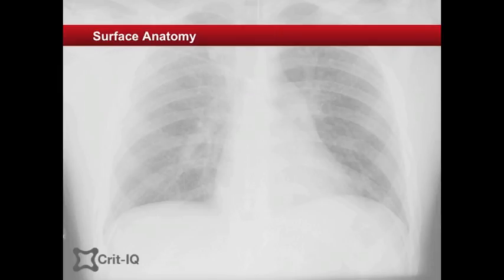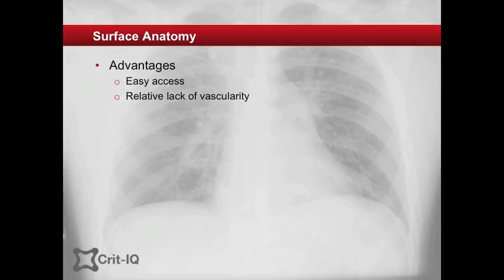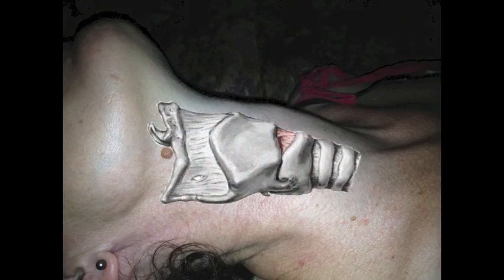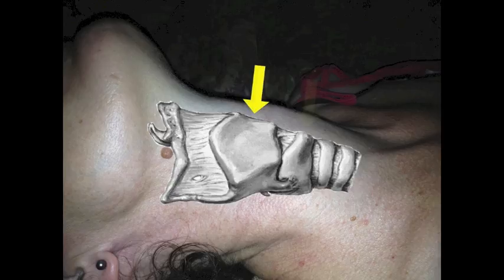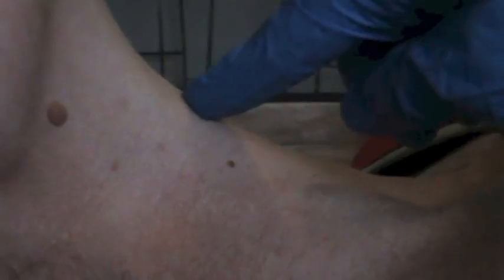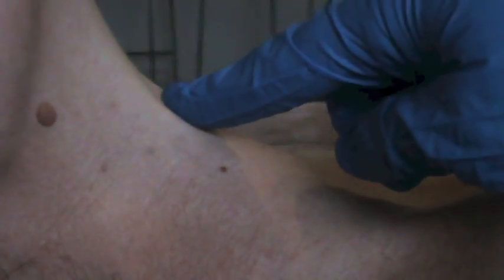The cricothyroid membrane is chosen because of its ease of access and relative lack of vascular structures. The membrane is located anteriorly in the neck between the thyroid cartilage above and the cricoid cartilage below. It can be located by placing a finger on the thyroid prominence in the midline and then running the finger caudally until the horizontal groove is felt.